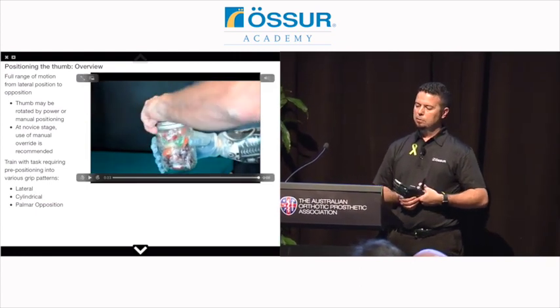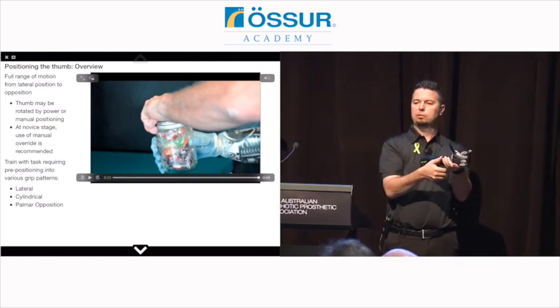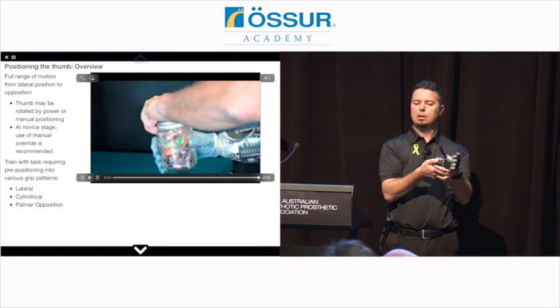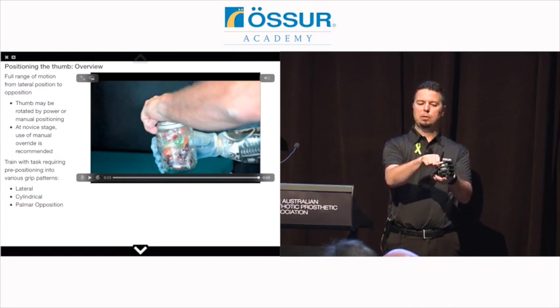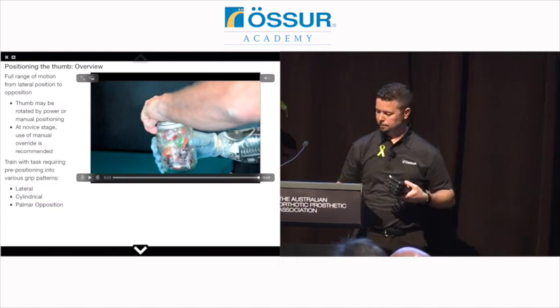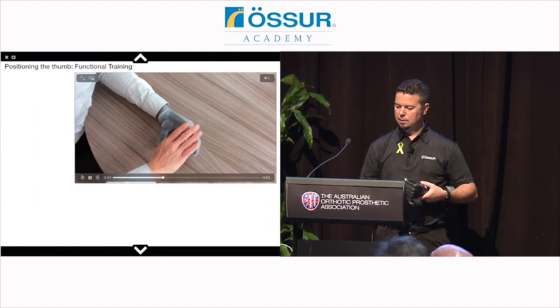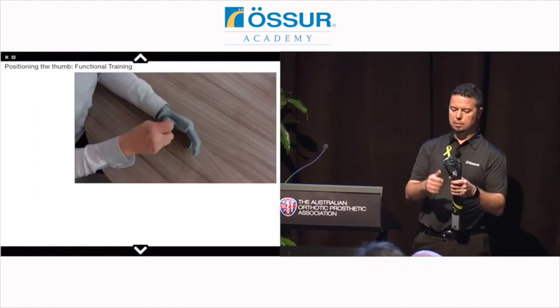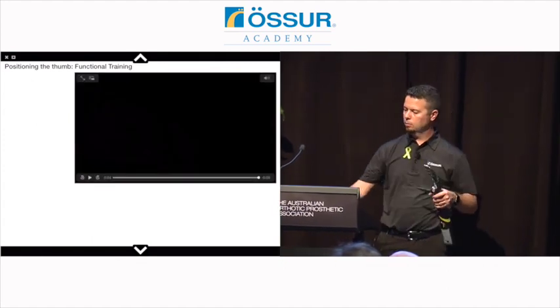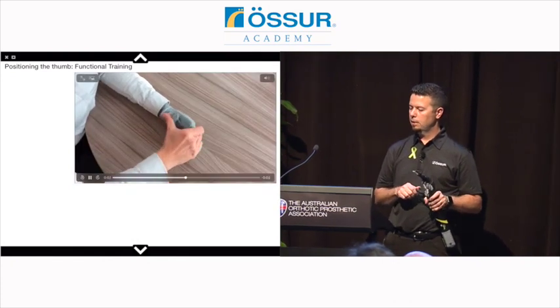The other thing I've noticed with thumb rotation is just a slight shift of the thumb can make a huge difference on some objects as well. It's not an all or nothing thing. This thumb can rotate. You can put it in any different position that you might want. And this is another functional example, just training that user where to rotate that thumb into different positions so they understand how that affects function.